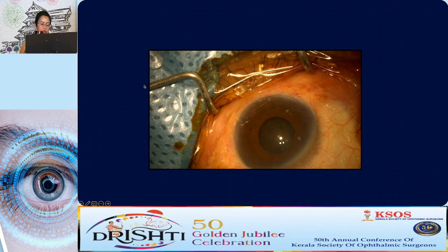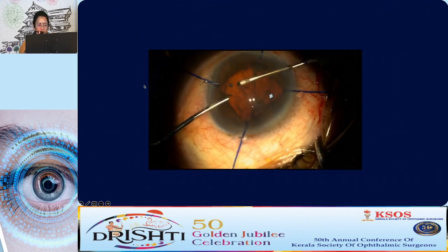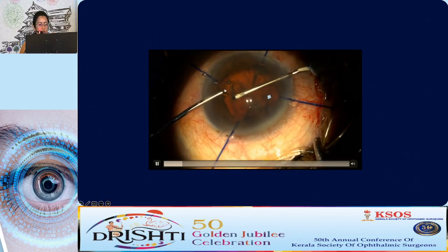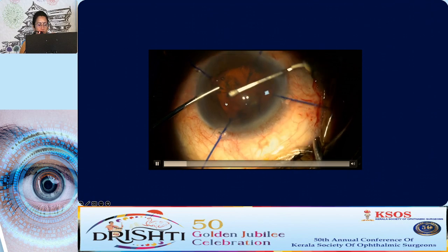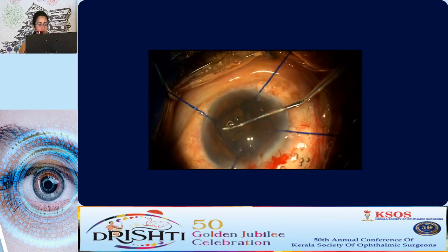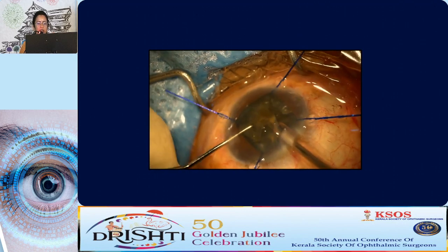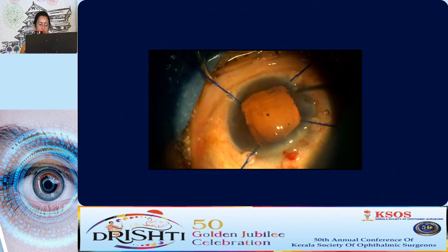Now this patient had a nucleus sclerosis of grade around 4 and the pupil was not dilating well. As you can see here, there are some folds at the apex of this rhexis, which indicates zonular weakness. And after the rhexis, a good hydrodissection was done, and here the nucleus was rotated, just pushing it down and then rotated so that the stress on the zonules is minimum.